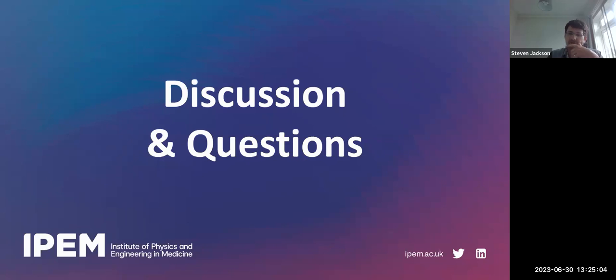I think if we're talking about Deep Resolve, there aren't that many parameters you can change anyway, and the short answer is the default settings generally do work quite well, and you won't need to change them. But if you're talking about accelerating imaging, then there are other steps you need to take as well as applying Deep Resolve. And as I said earlier, we're hoping to share some example protocols. So when those are available, you'll be able to see some examples of what's been done elsewhere and how protocols have been optimized.